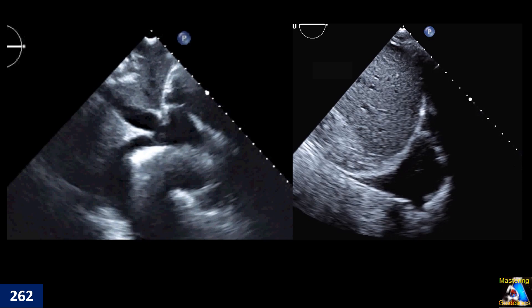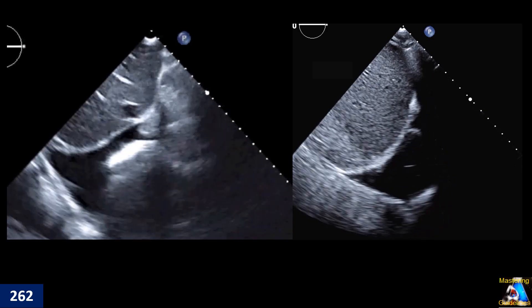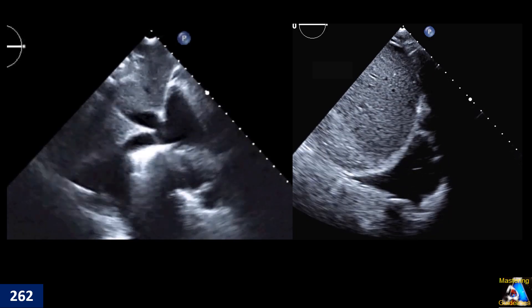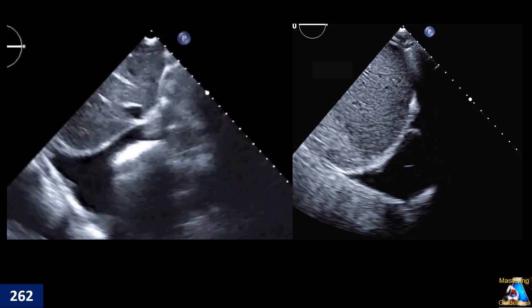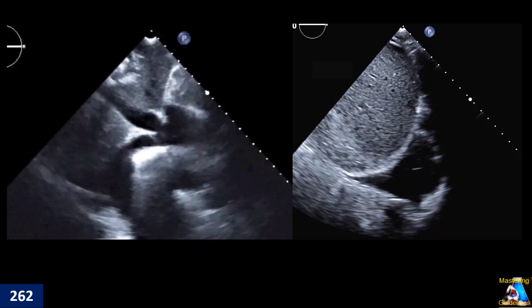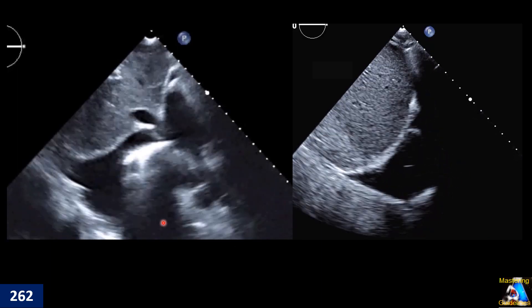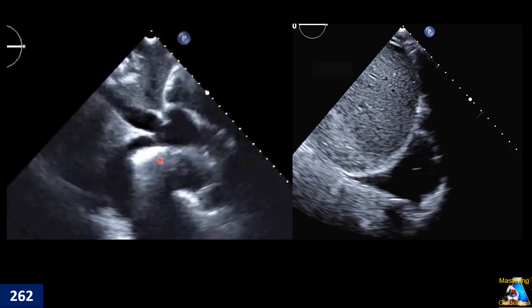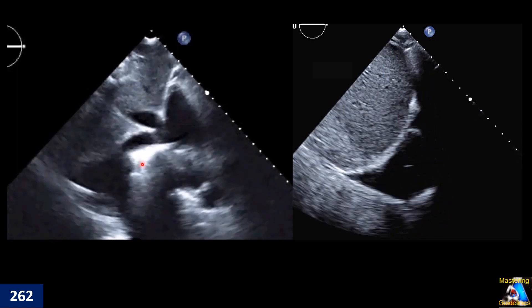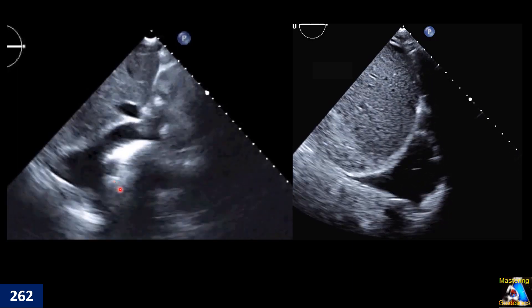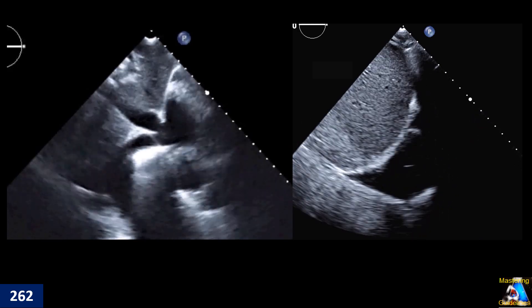You are going to the subcostal view, finding the IVC. Then you're finding left and right. You have two different patients — one of them is this and another is this one. What finding are we seeing in each of these two clips?